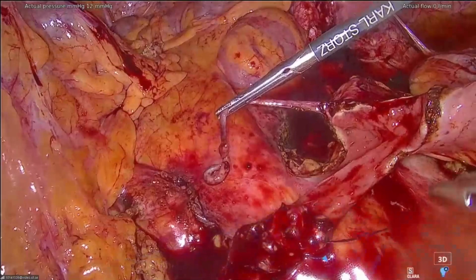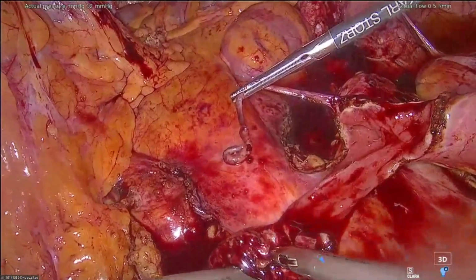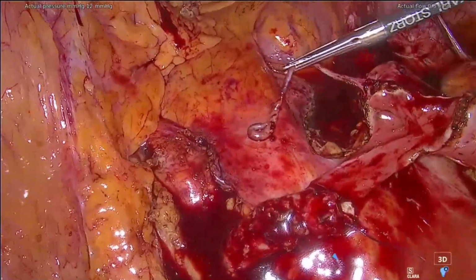The model that you use is okay, it's fine. For me, I see nothing without my glasses. A 26 is enough, a short one, because we're already in the middle of the ureter. Okay, give me another suture, the same suture. And I have to do the second layer.